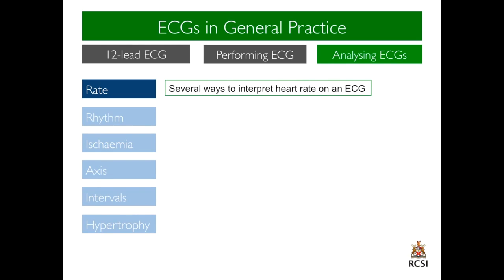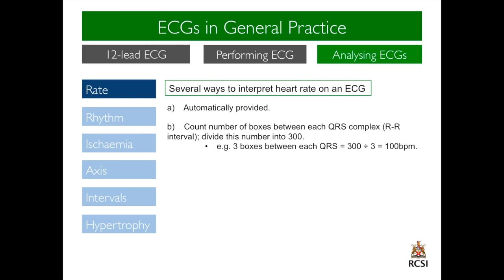There are several ways to calculate the heart rate on an ECG. The rate might be automatically provided as part of an automatic ECG. However, this should not be assumed. You must know how to calculate the rate.